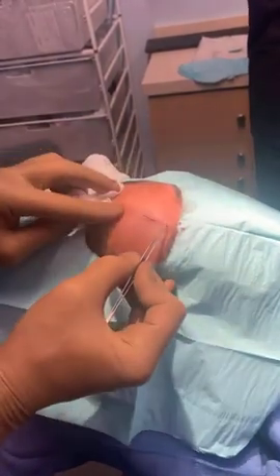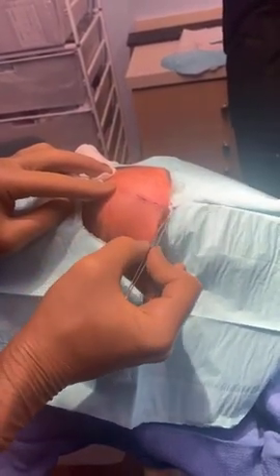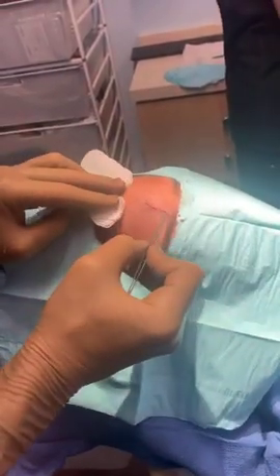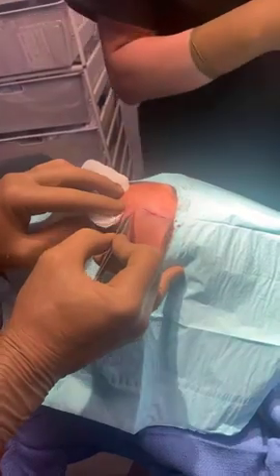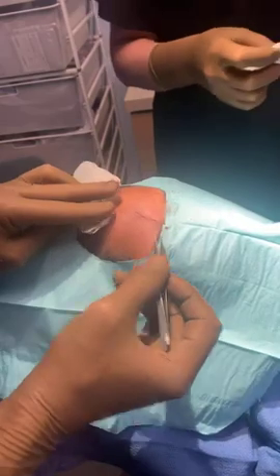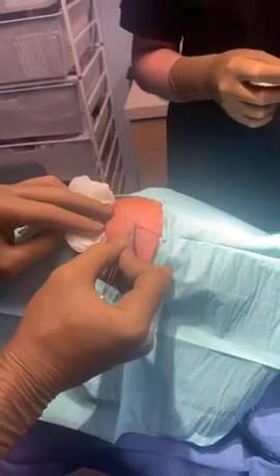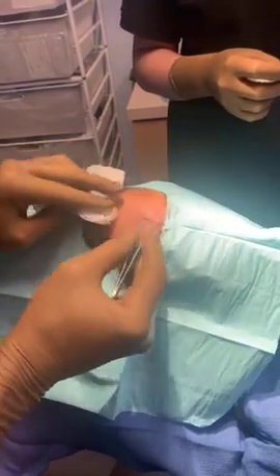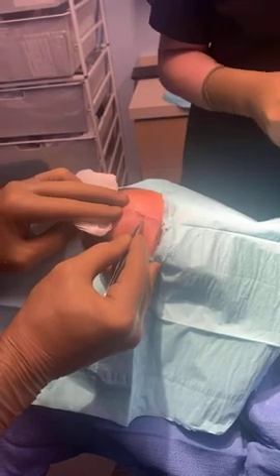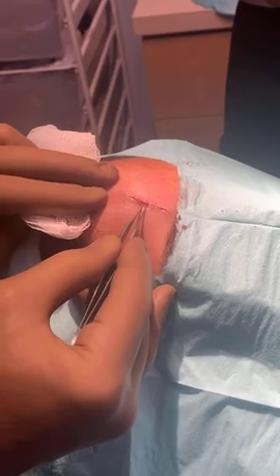The only way for me to take that out, if I needed to in one fell swoop, was to come down like this into her brow and then come back up again, which would have left her a fine line here, but extending from up here and then possibly even going into her eyebrow, which would not have been favorable. So I just sort of did it piecemeal. I took a little bit out and closed it, took a little bit more out and closed it. And finally, you can still see that this edge right there might not be the most perfect edge, and that's because that's still a little bit of the scar.